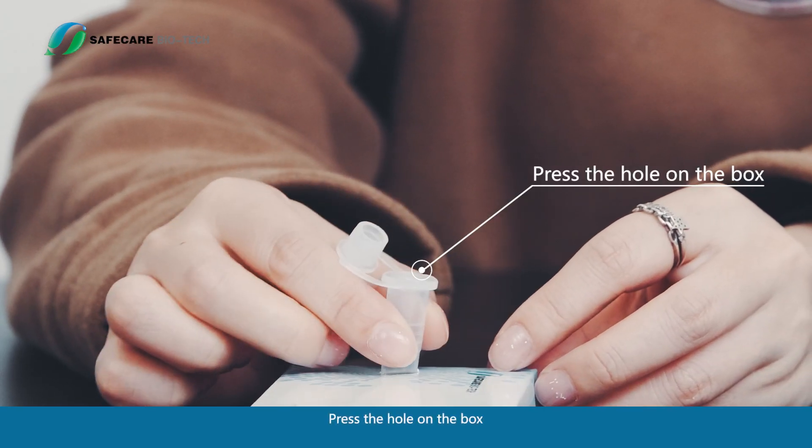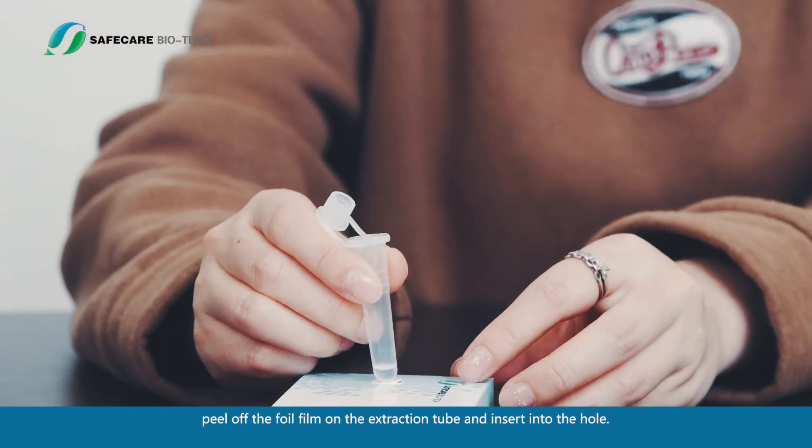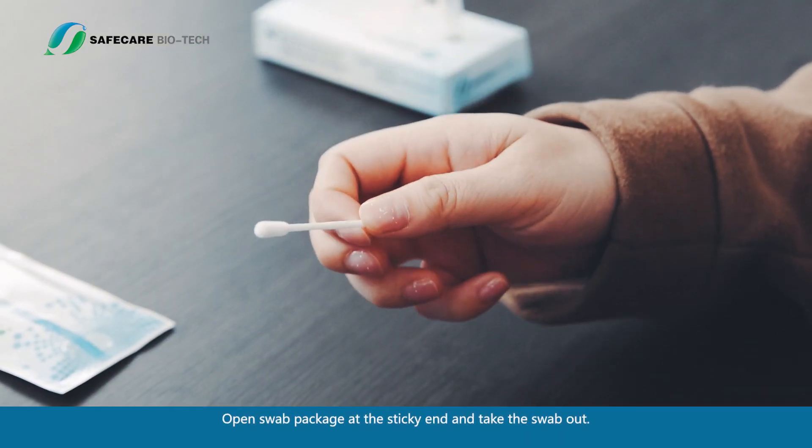Press the hole on the box. Peel off the foil film on the extraction tube and insert it into the hole. Open the swab package at the sticky end and take the swab out.